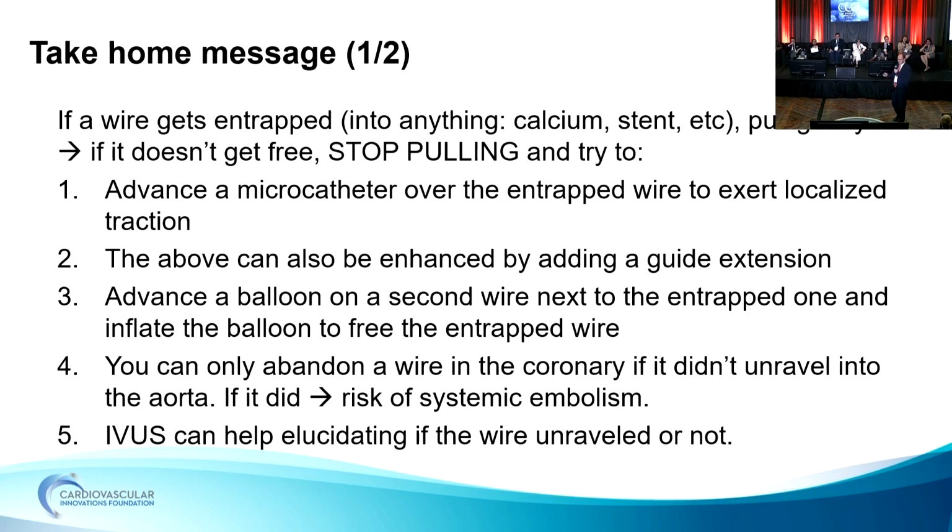So in a different form, I condense this algorithm in this principle. If this wire gets entrapped, we have to pull it gently.